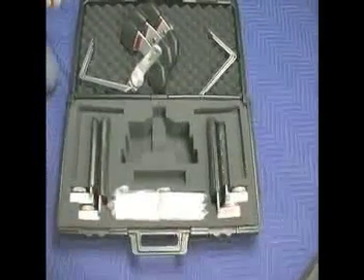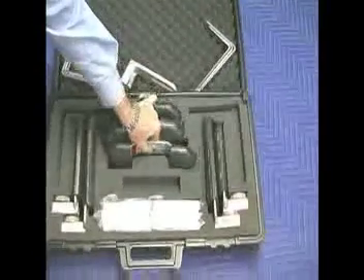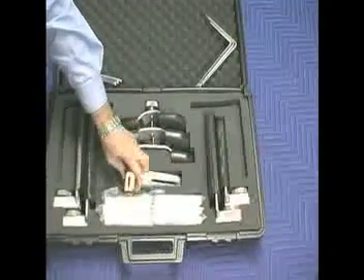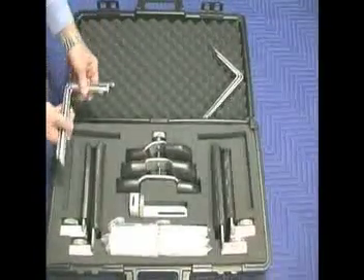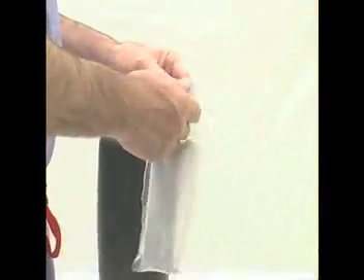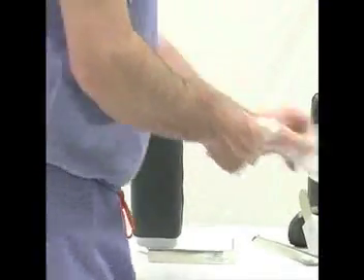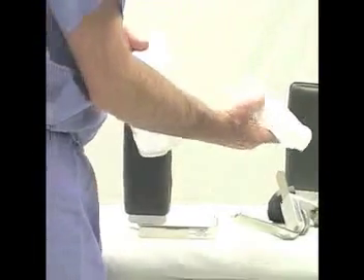A durable case with foam cutouts organizes the many components of the Hip Grip. There are four upright supports and three sizes of anterior pelvis supports. There are two small, two medium, and two large three-degree canted L bars to attach the Hip Grip to the operating table.